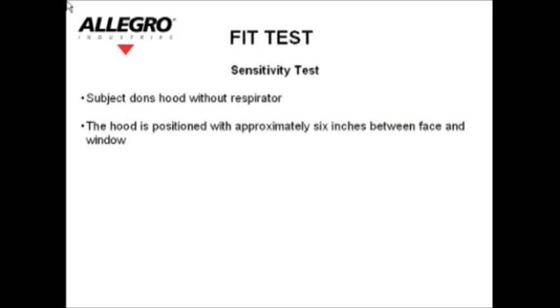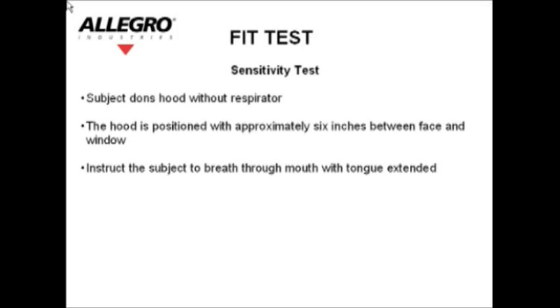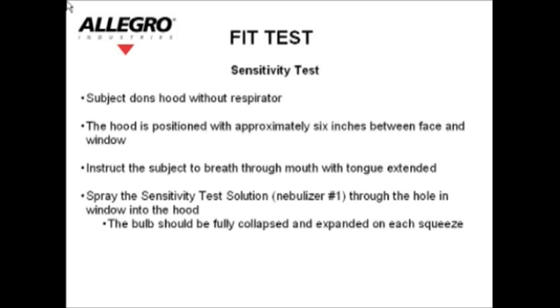Sensitivity test: the subject dons the hood without a respirator. The hood is positioned with approximately six inches between the face and the window. Instruct the subject to breathe through their mouth with their tongue extended. Spray the sensitivity test solution — nebulizer number one — through the hole in the window into the hood. The bulbs should be fully collapsed and expanded on each squeeze. Direct the nozzle away from the nose and mouth. Spray 10 times. Ask the subject if they can detect the taste of saccharin, and note the number of squeezes if detected. The test threshold is noted as 10 regardless of the number of squeezes actually completed.